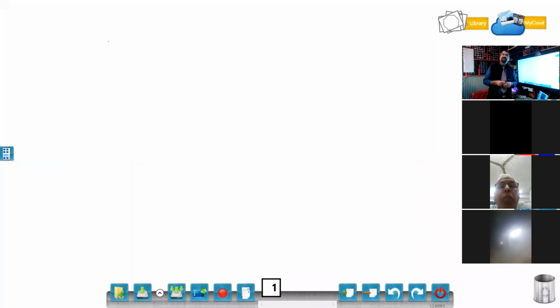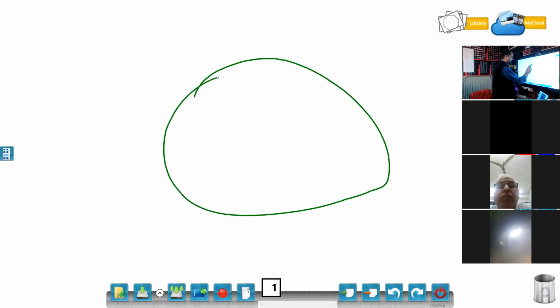There is one point which I will give you: whenever you put a color box on a ureter calculus, there is an artifact, which is a twinkle artifact. We have shown you some patients of this twinkle artifact in your courses. Now, this is the ureter over here.